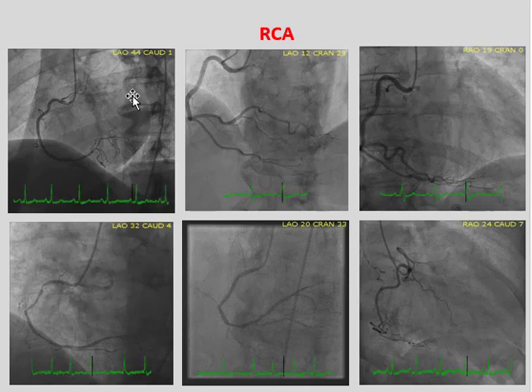In the straight LAO, the backbone is on the right. However, they can magnify the image and center it, so the backbone is not that clear. In the straight RAO, once again, the backbone is on the left, the opposite side of the detector, and depending on the orientation and the angulation and the magnification, you may not always see it.